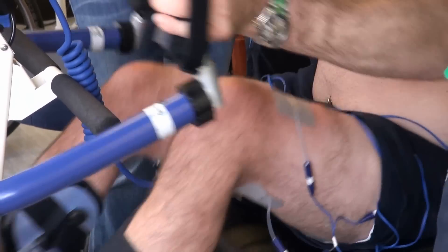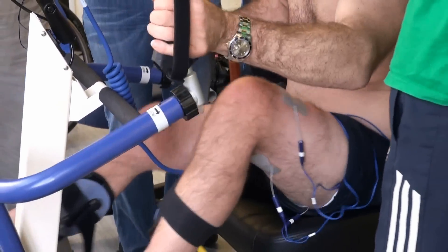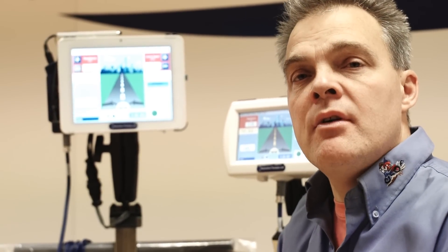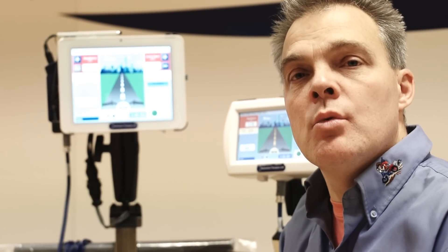This means we can stimulate a massive array of muscles — tibialis anterior, gastroc, quads, hamstrings, glutes, abdominals, and erector spinae — meaning that we're very, very close to simulating walking patterns.